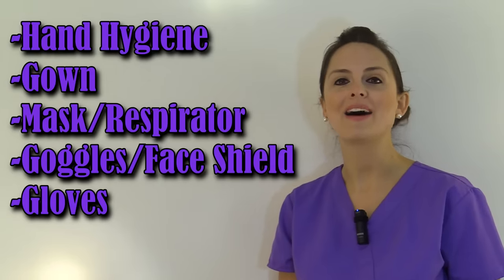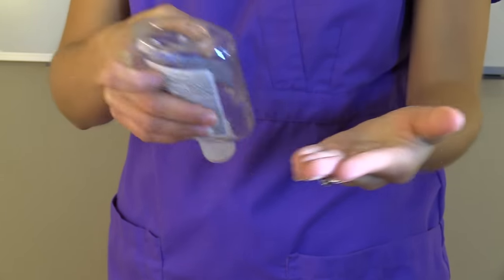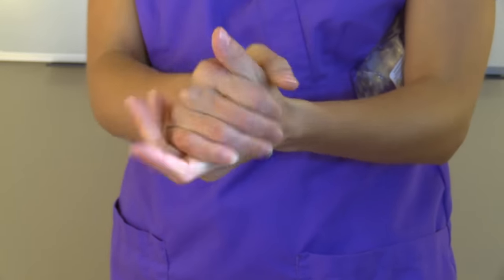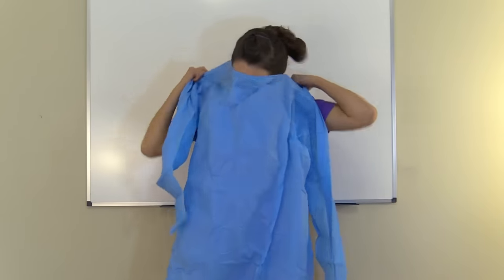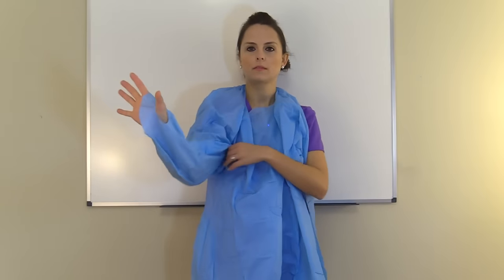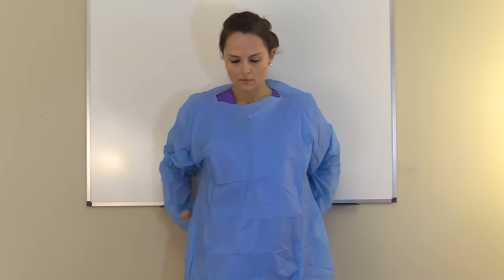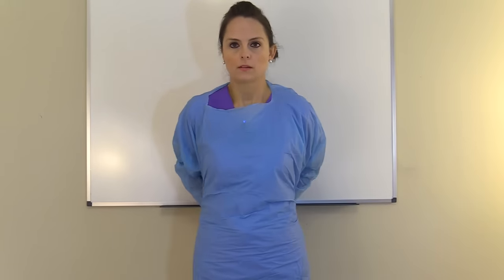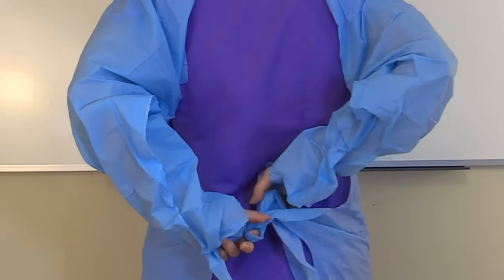Now let me show you how to do that. First, perform hand hygiene. Then we're going to put on the gown — put it over our head and slide our arms through the sleeves. This particular gown has hooks where you stick your thumb, so be sure to use those because that will keep your gown secure while you're providing patient care.